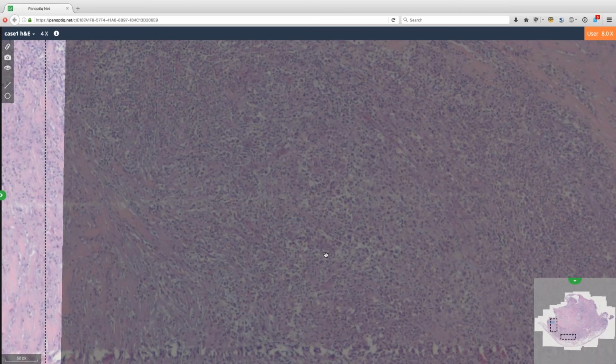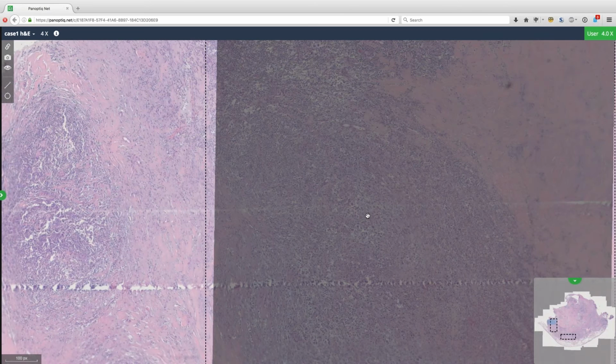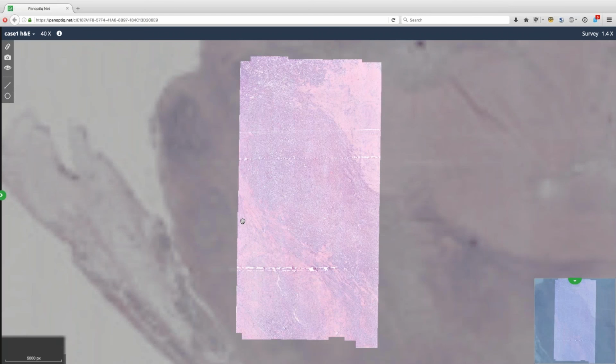Okay, there we go. We'll give it a few seconds to come into focus. So this is a very interesting lesion. It actually does present predominantly in young female patients and can very easily be missed because it can be asymptomatic.